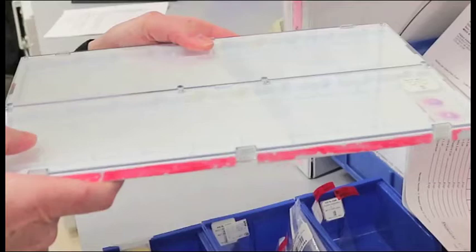Actually, one of our very competent medical technologists said, how can we make them stand out? Well, what stands out more than brightly painted nail polish? So all she did was apply some nail polish on the side, and whenever in our routine practice we get these slide trays, they stand out because they are pink and shiny, and we know that we can stop what we are doing, quickly look at the case, mark the area with the tumor, and then inform the molecular lab. So that way the molecular lab is no longer waiting for the pathologist to look at the slide. They can get on and load the assay as soon as possible.